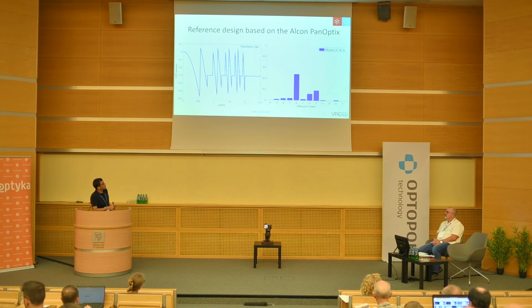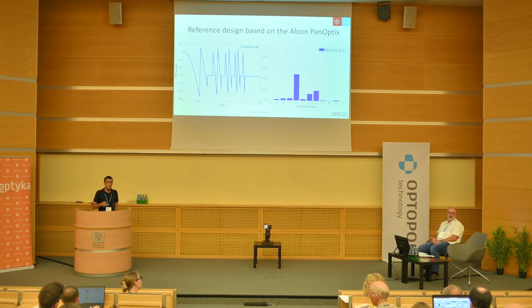And you can see, if you do a Fourier transform of the period of this profile, this is how the amplitude of the principal Fourier coefficients looks like. So you see that you have more or less three principal foci. But because it's a repeating pattern, it's a diffractive lens, you lose part of the energy. You don't have 100% of light in here.